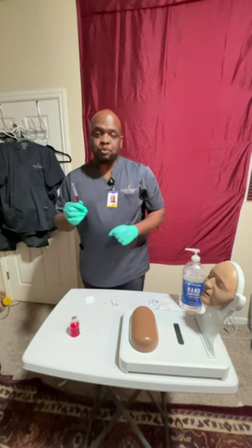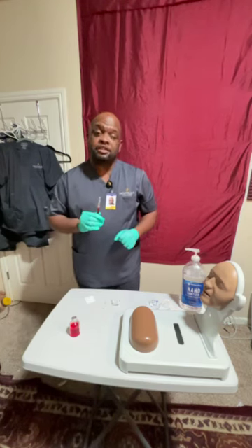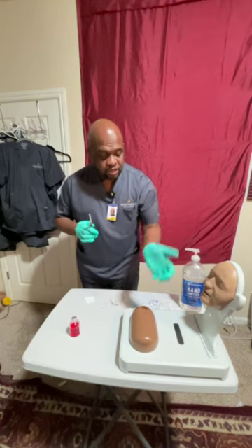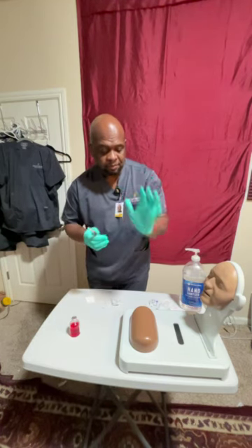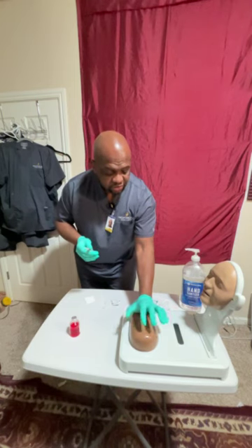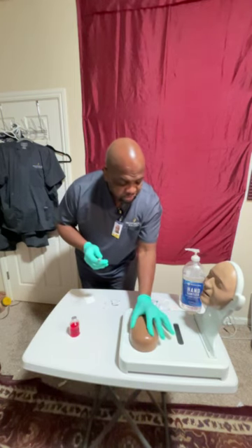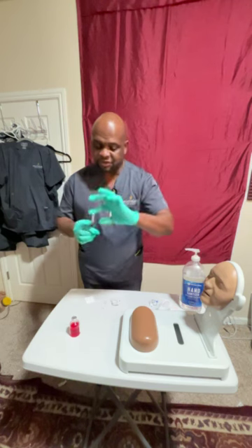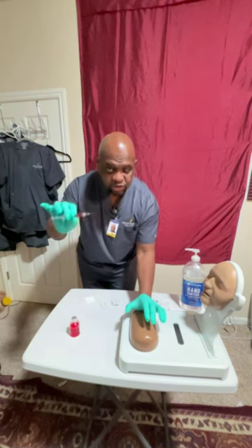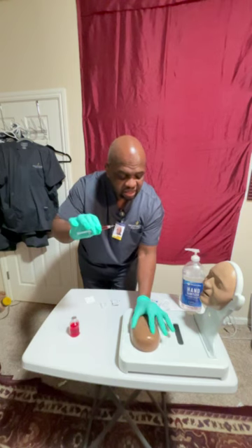And yeah, I'm going to go ahead and give this injection, right? So everything looks good with the 6 rights. That's my 3rd check. So I'm going to use the palm of my hand and place that down on the areas that I mentioned, the greater trochanter, and I'm going to form that triangle that I was telling you about. Oh, let me first. There we go. Palm of my hand. Hold the syringe like this, and I'm going to come in 90 degrees.